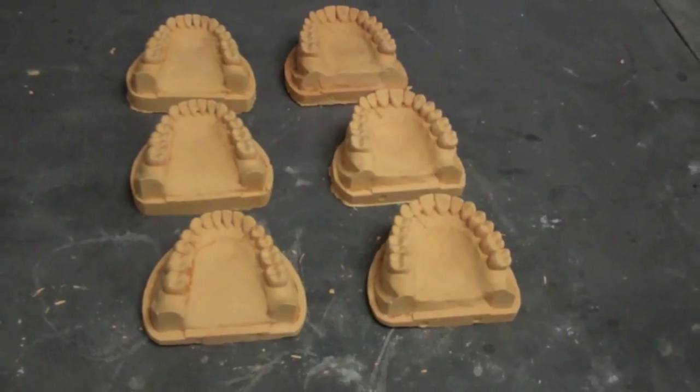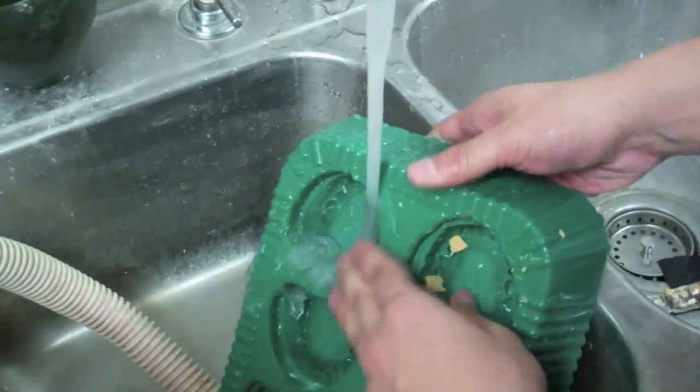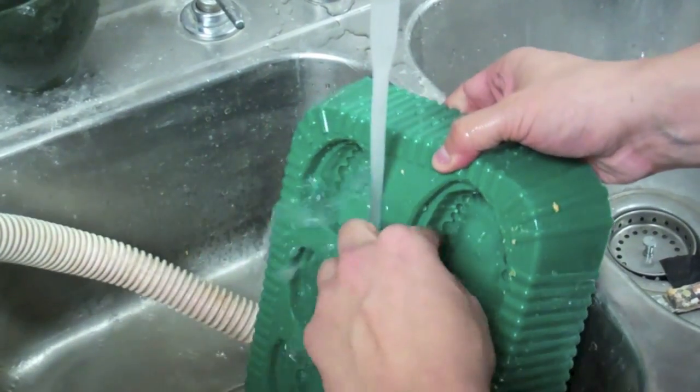Once all six models are removed, you must clean the mold and then you are done with the exercise.